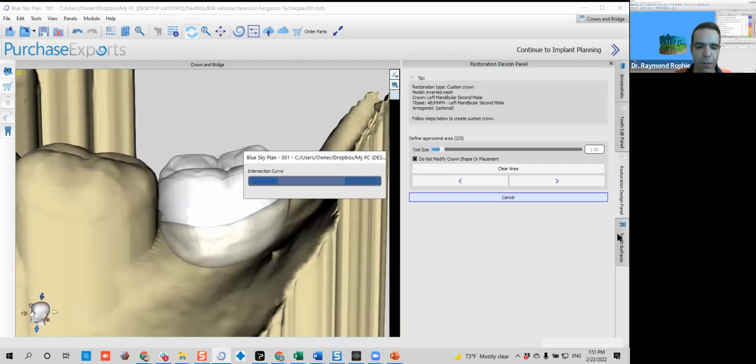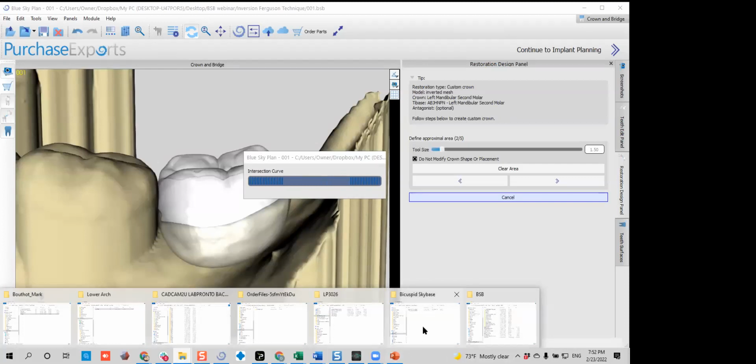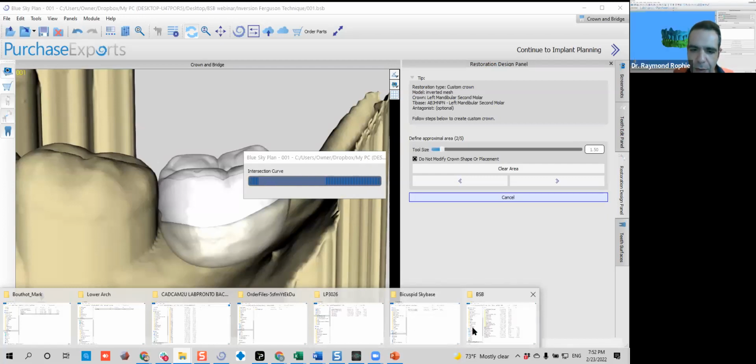Okay, so I will wait. Of course, this is a live webinar, so that's why this is happening. Any more questions meanwhile? There's a question if we're able to invert existing teeth, which is a functionality that we don't yet have in the software. So you're right, you can't invert an existing tooth. We will have it, but now it's not possible.